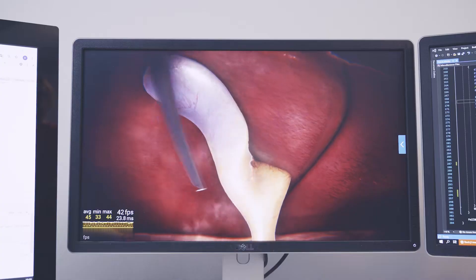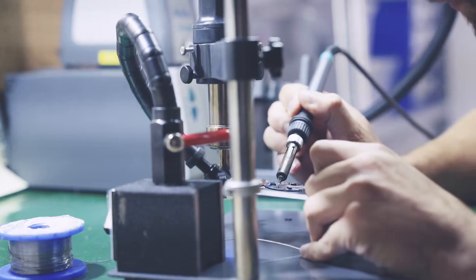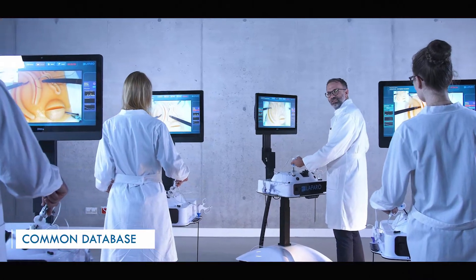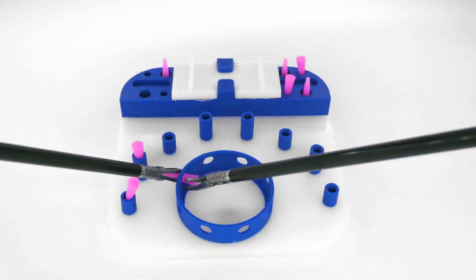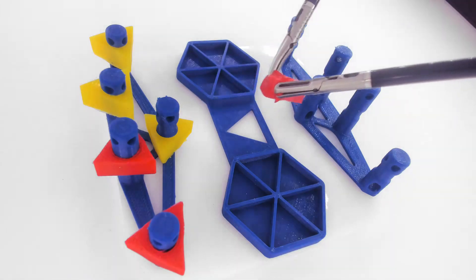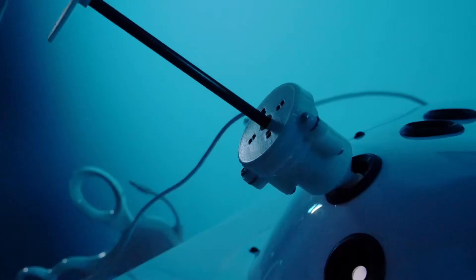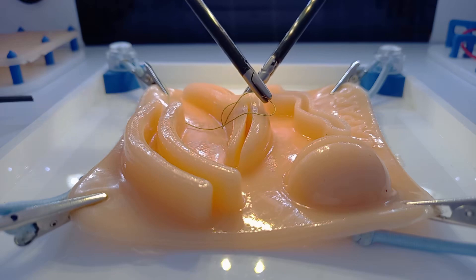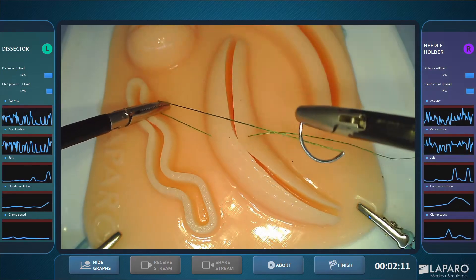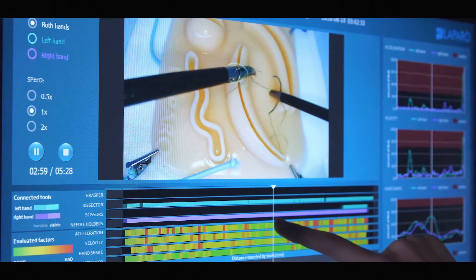We here at LAPARO understand this difficulty better than anybody else. We have used our engineering know-how to develop incredibly innovative solutions which optimize the relationship between the mentor and the student. In our devices, rich training exercises and step-by-step tutorials greatly improve the learning process. For instance, the LAPARO Analytic is equipped with precise sensors which track the movements of the instruments and provide detailed feedback and analysis to the users.